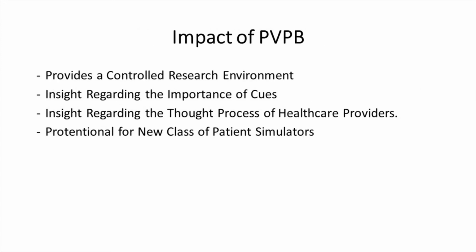The impact of the physical virtual patient bed for research is that it provides a controlled environment while trying to get insight regarding the importance of cues and how that affects the healthcare provider's thought process during diagnosis. In the future, the physical virtual patient bed could become a new class of patient simulators.